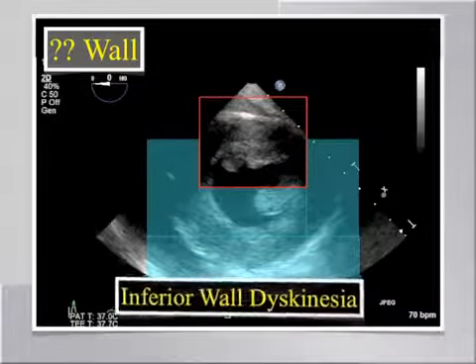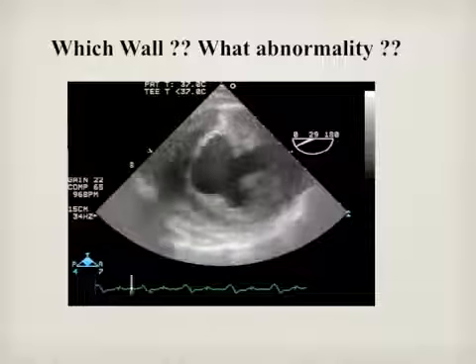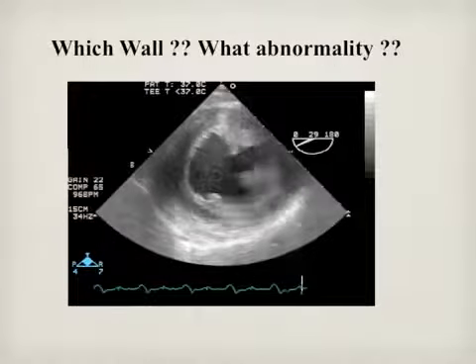Here we see inferior wall dyskinesis in the transgastric mid-papillary view. Please identify the view and wall motion abnormality in this post-bypass patient.